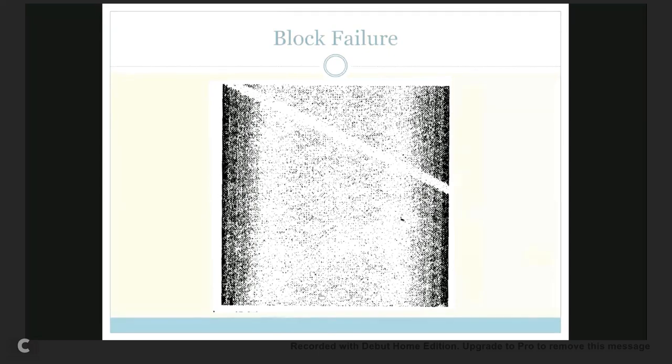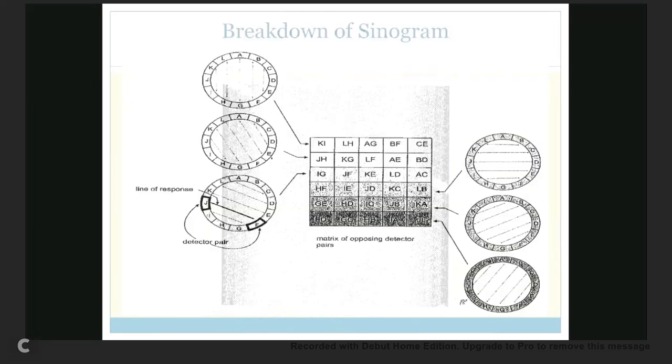The fact that this whole entire thing going across up is one chunk is because it's a block detector. You remember the picture, how it's like one big chunk? So this whole part here is going to be messed up and has to be replaced. Just the PM tube or the whole block? The PM tube, because it's not your crystal itself.